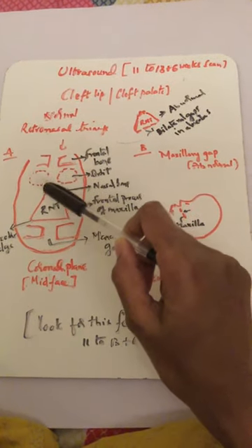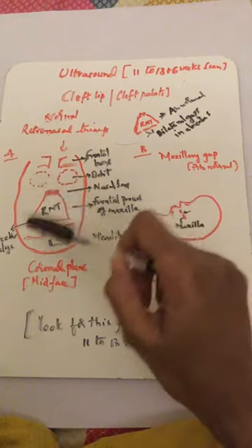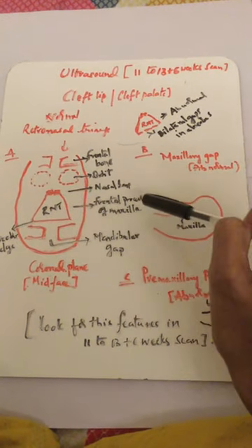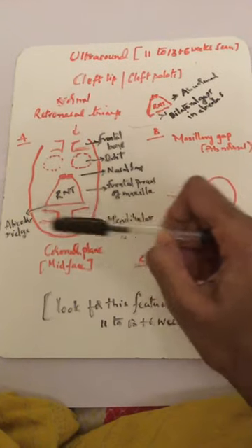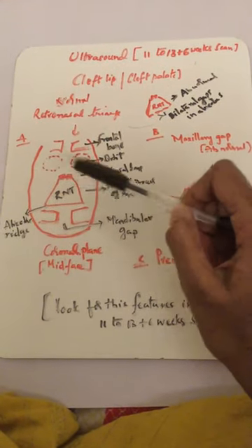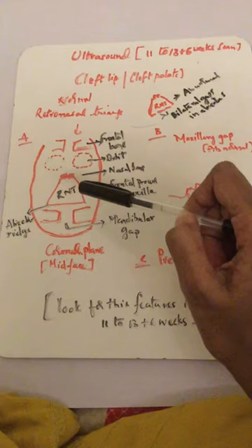The retronasal triangle is formed above by the nasal bone on the sides, by the frontal process of maxilla, and below by the alveolar ridge. This is normal. The retronasal triangle is formed by nasal bone, frontal process of maxilla, and alveolar ridge.